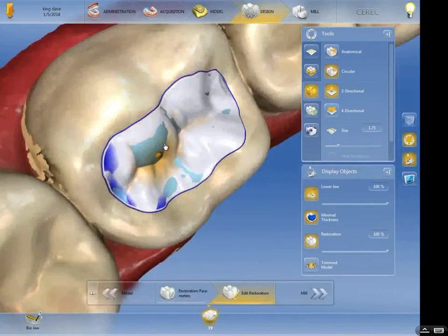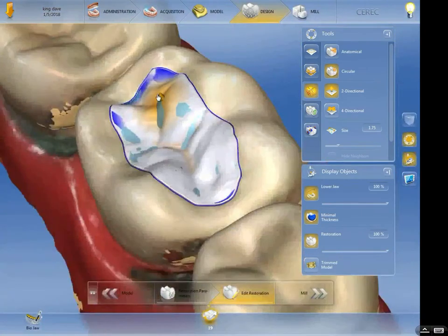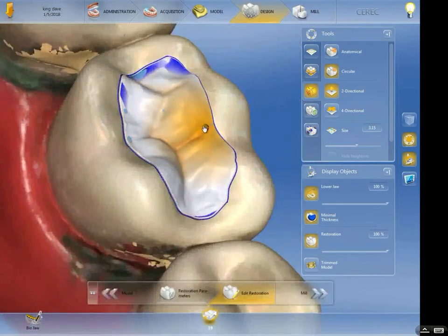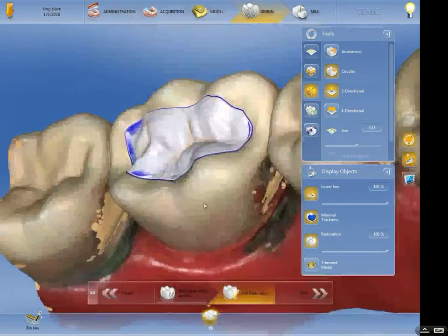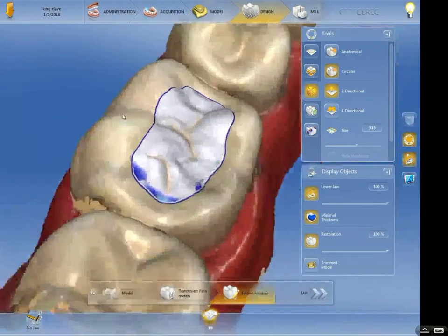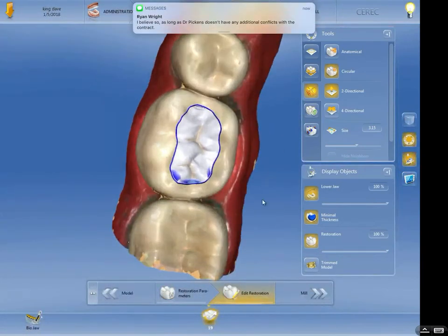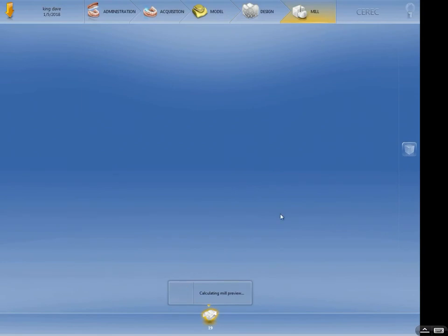So we'll get this all designed. And again, just like a composite resin, I'm going to adjust this intraorally after it's placed. That's one of the reasons why some of those hybrid composites, the CEREC, Vita Enamic, and the Lava Ultimate, are so great with regard to the design. Ouch. Remember when I hit myself and I said ow? Yeah. Nice. So that took, what, 4 minutes?